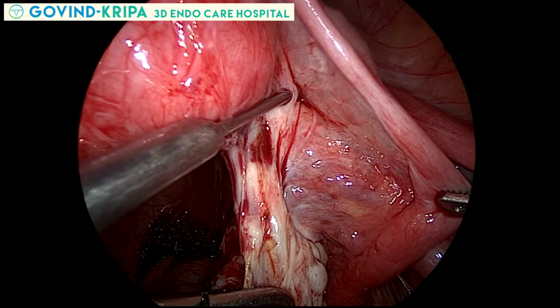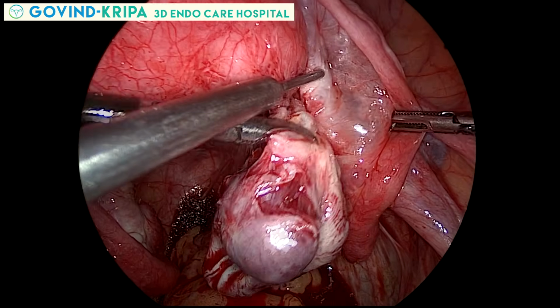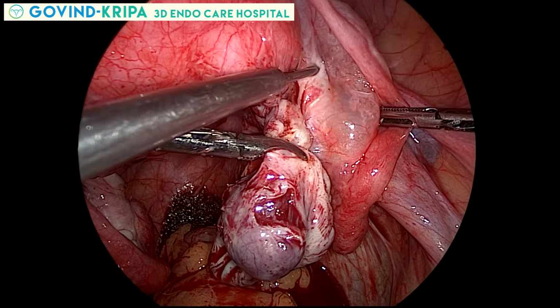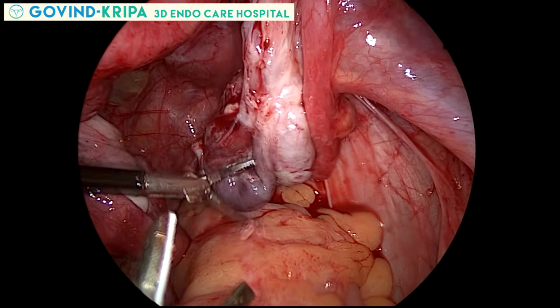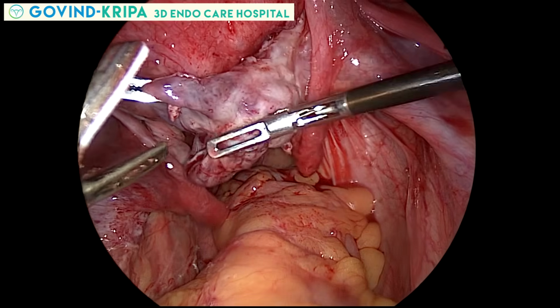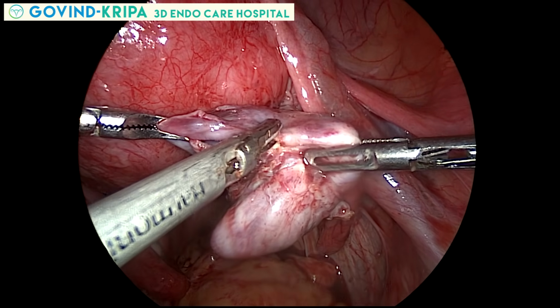Injection vasopressin is infiltrated in its diluted form into the ovarian ligament, and then we proceed for the ovarian cystectomy. As the cyst is small and it is mostly projecting out of the ovarian substance, it is easy to peel it off.